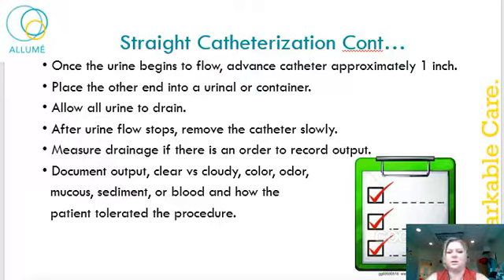Document the output, clear versus cloudy, the color, the odor, if there's mucus, sediment, or blood, and how the patient tolerated the procedure.